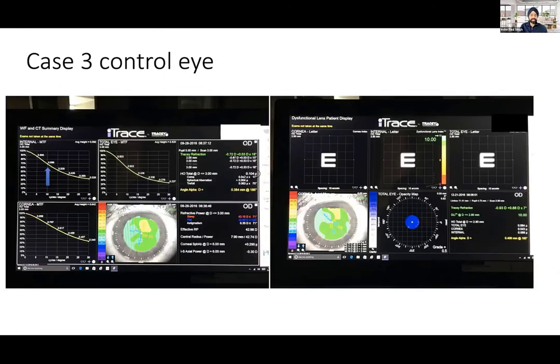This is the control eye. This is the other eye. This is the right eye of that patient here. Just showing you, again, the contrast, same scans, was good. DLI was good, patient had no floaters. So again, this is showing you that it's not just the machine telling us something. The other eye was doing very well too, had no symptoms, had no floaters, and you can see how nicely healthy that other eye was as well. So these are kind of the examples that we're finding.